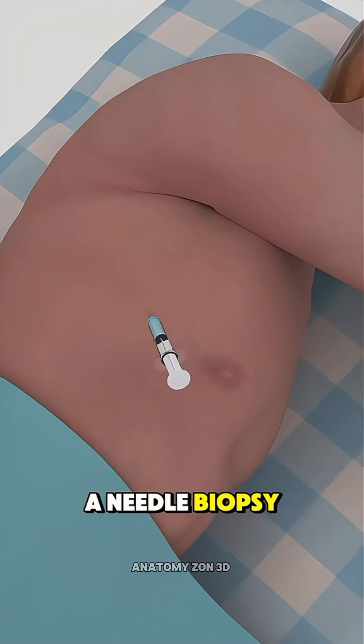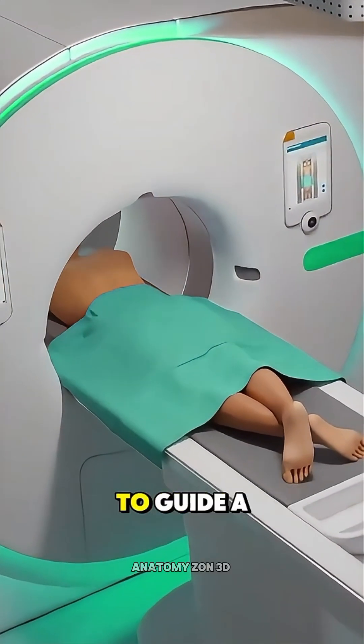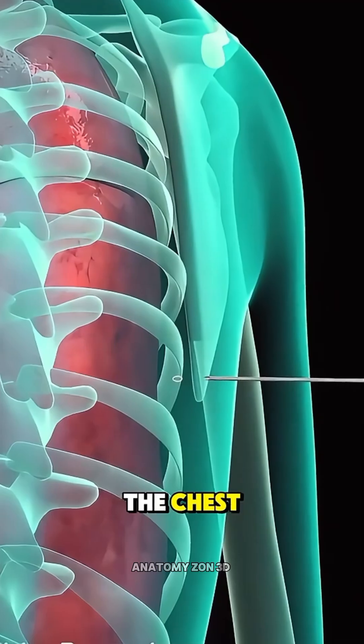If it's near the chest wall, a needle biopsy is performed under local anesthesia, using a CT scan or ultrasound to guide a thin needle through the chest and into the lung.